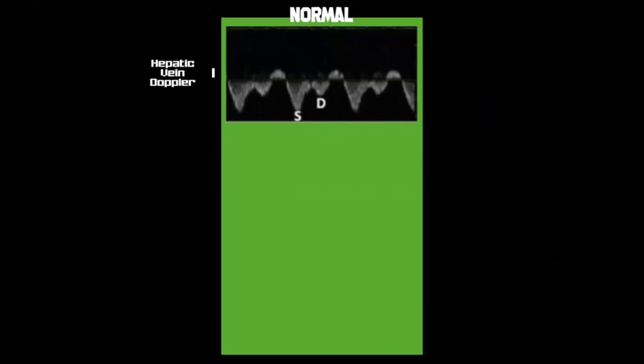What we're going to talk about is what normal flow looks like. The concept behind the venous excess scoring, or VExUS scoring, is basically about giving everybody a way to grade the abnormalities, or lack of abnormalities, that they see.